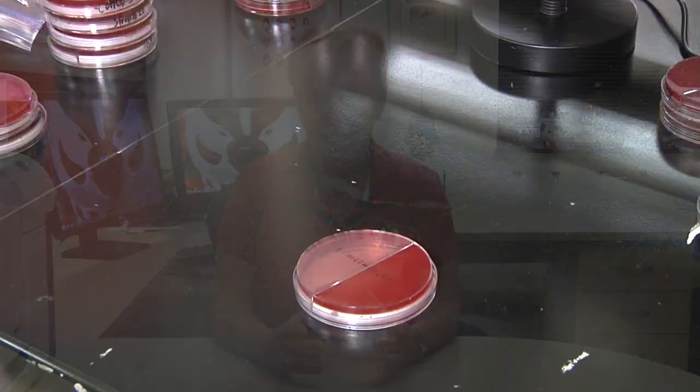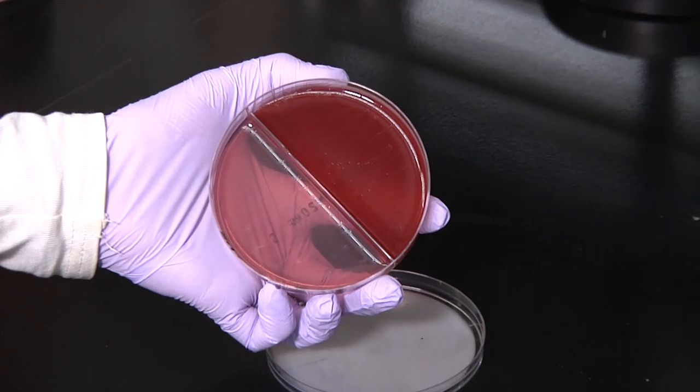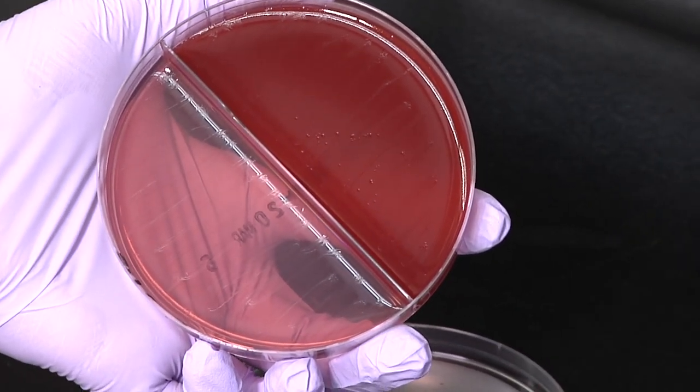So the earliest that we want to read the plates is after 24 hours of incubation. And the very first question that we ask when we look at the plates is, is there any evidence of bacterial growth on these plates at all? Now that sounds simple, but sometimes it's not as simple as it seems. One of the things that we need to differentiate sometimes is small clots of milk from the mastitis itself. Sometimes there's little clumps of fat. And then sometimes, like seen in this plate, there's small pits in the agar that, if we don't look carefully enough, we may confuse with bacterial growth when in fact they're just pits in the agar.